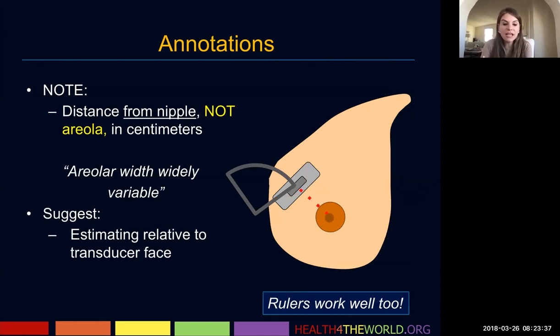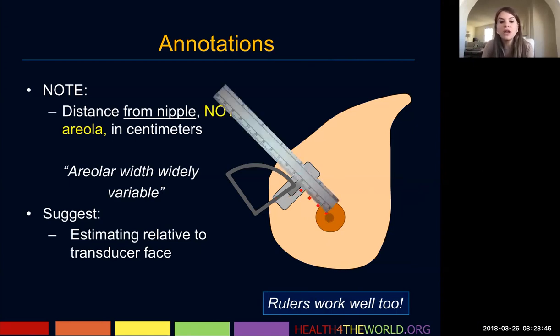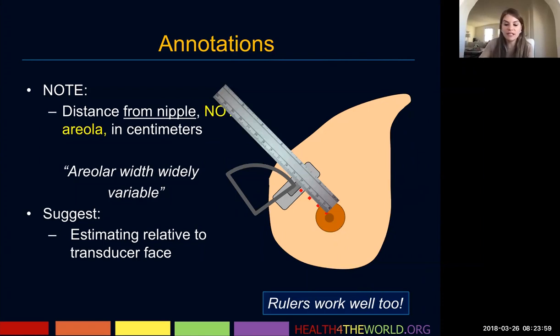They suggest estimating relative to the nipple, but rulers work well too. We keep some plastic rulers in our ultrasound rooms. I find this more helpful with a woman with a very large breast where I want to be more accurate to make sure that my colleague can find the same lesion.